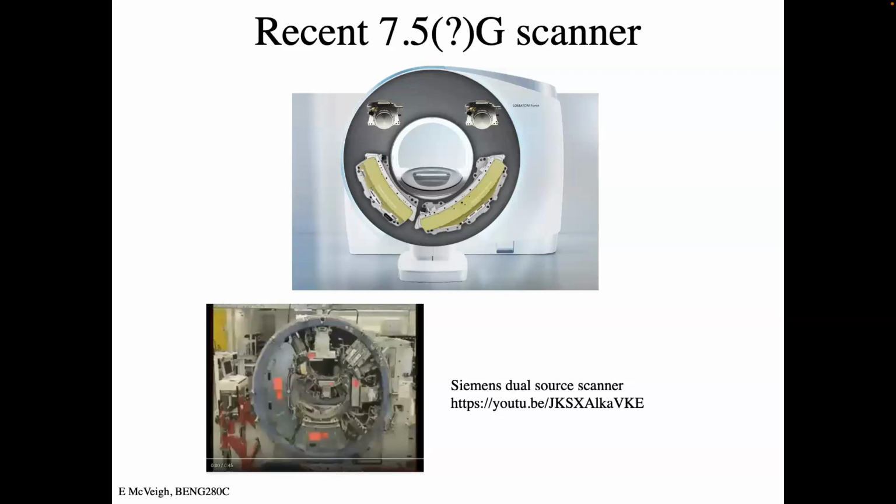The other thing is that the heart itself can be undergoing a slow change over time, like the heart rate can be changing slowly, or they can throw a single bad beat into your soup. So if they have an ectopic excitation, or a skipped beat, sometimes, as you would call it, then if one of the 3 heartbeats used for making the images is that skipped beat, the whole thing looks like a mess, right? So there's a big chunk of the heart that just looks quite different. So this is not my favorite design for cardiac scanning. I prefer the single detector that gets the whole heart in one go.